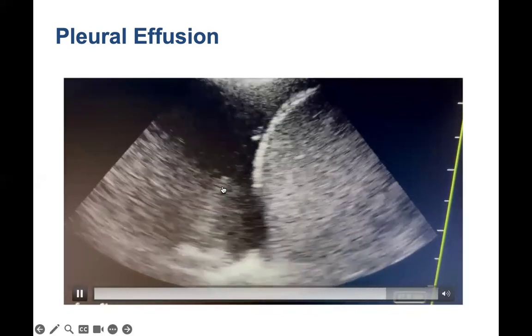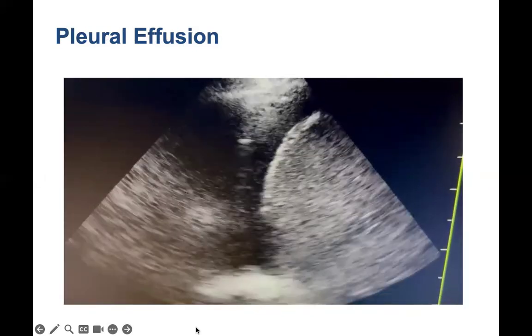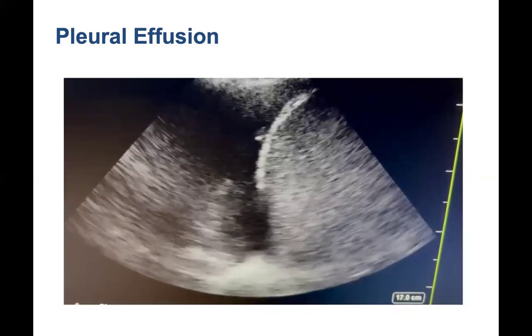And as the patient breathes, and that diaphragm moves a little bit, you can see the lung, again, peek out and wave at you. And I would consider this a large pleural effusion.